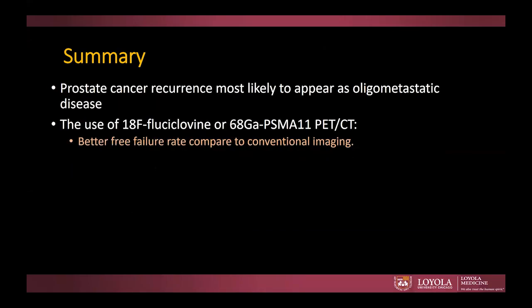And also remember that prostate cancer recurrence is most likely to appear as an oligometastatic disease. This is not uncommon. And the use of fluciclovine or gallium PSMA PET-CT scans shows better failure-free survival rate compared to conventional imaging.